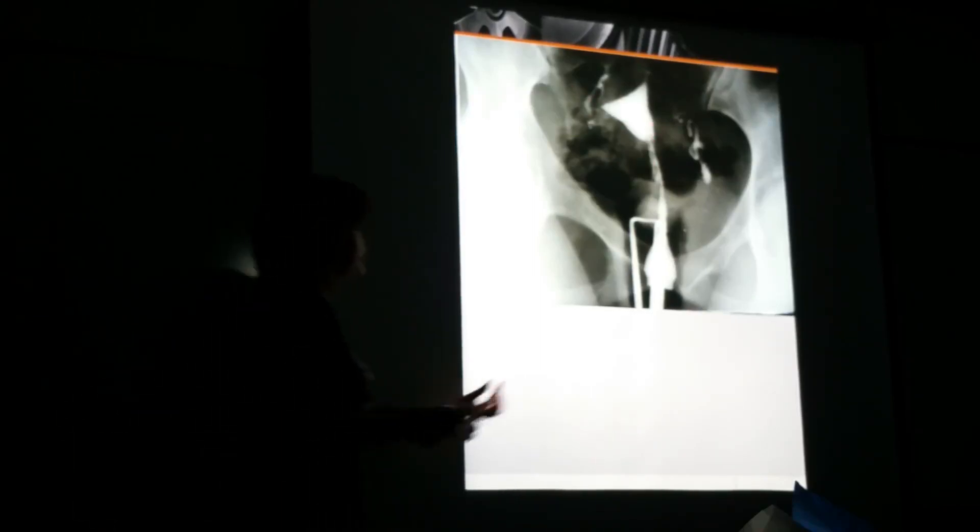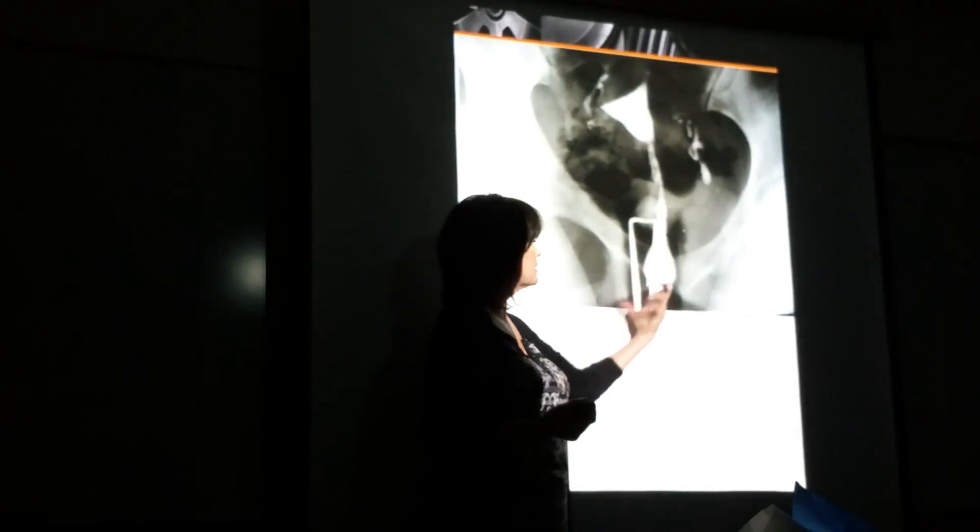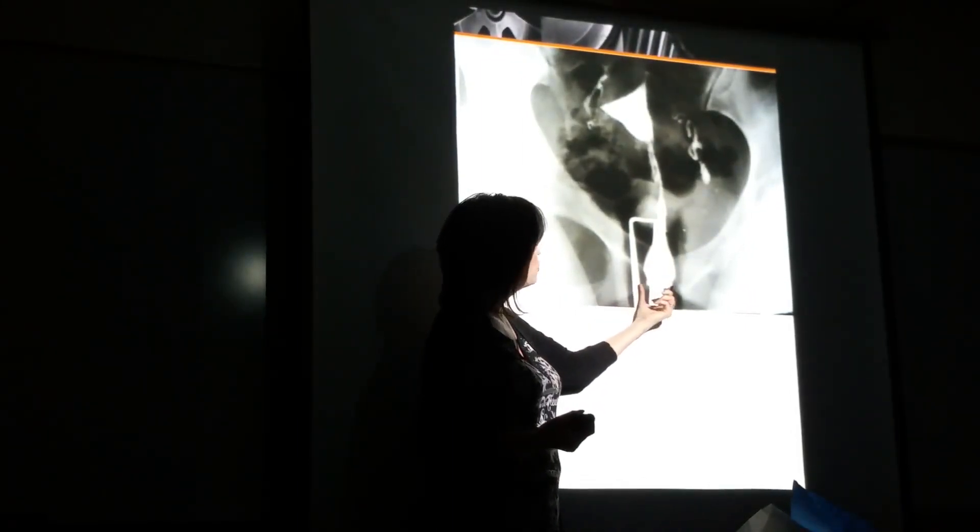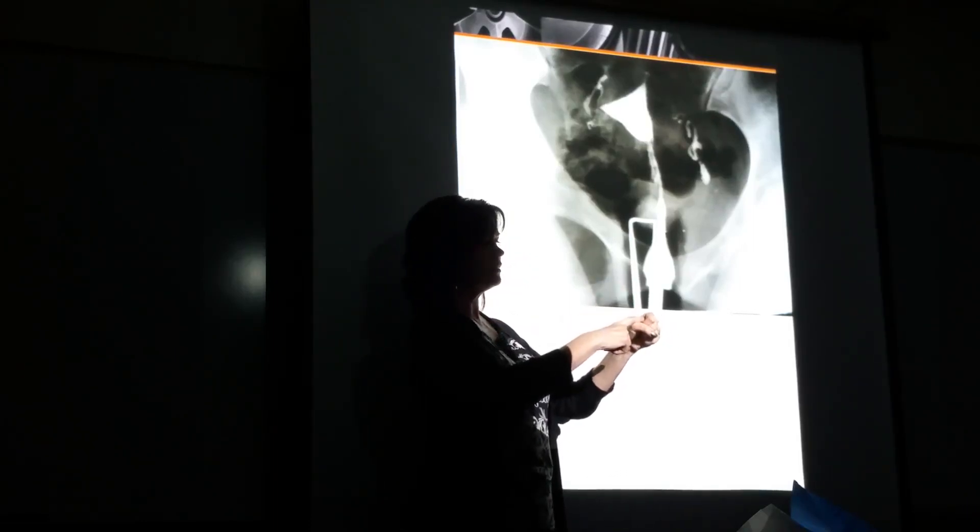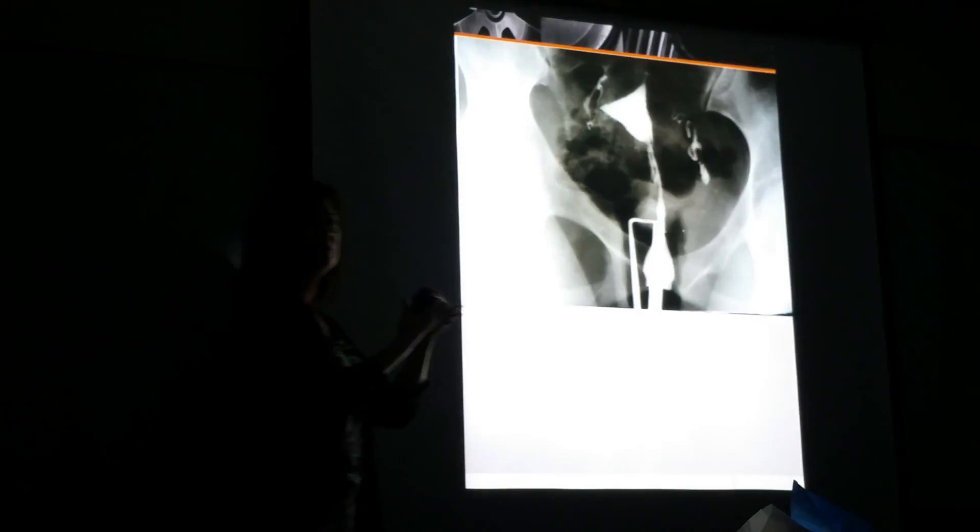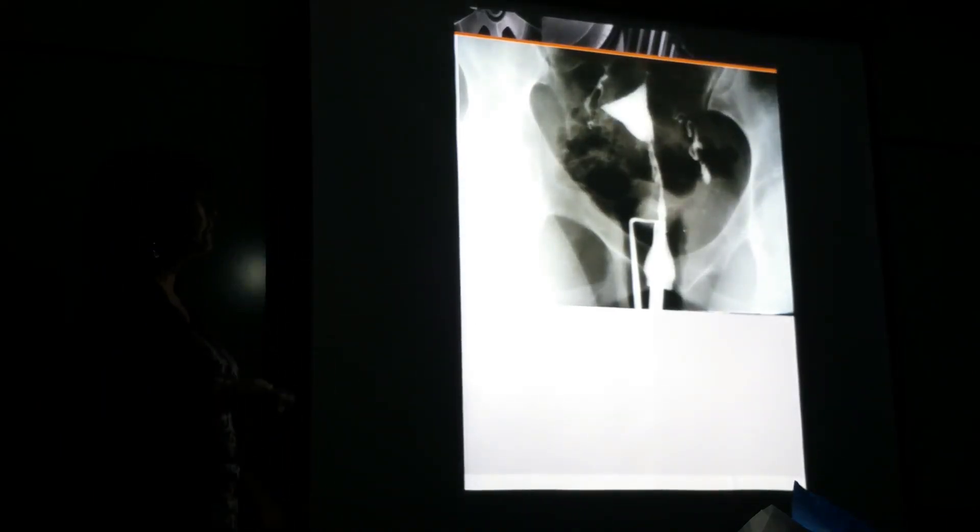Here is another one. Notice how it's tilted. They're not using a balloon, they're using a little stopper. This is a more old-fashioned one where it's not a balloon on the internal os, it's on the external os - it's a stopper between the external os and the vaginal canal. You can see they use the tenaculum here.